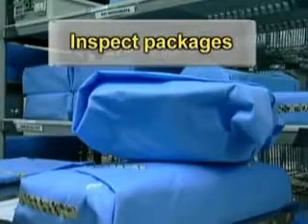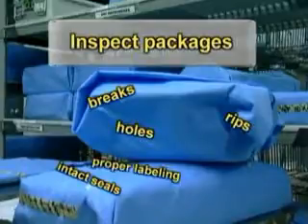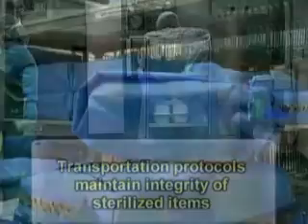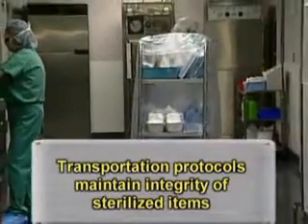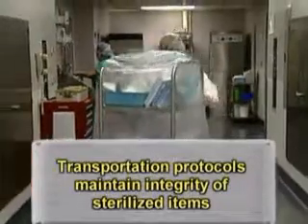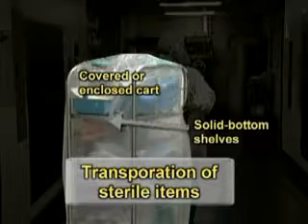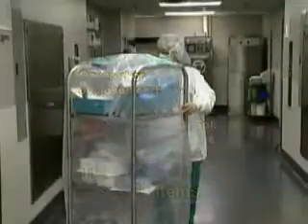Sterilized packages should be inspected for breaks, rips, holes, and for intact seals and proper labeling. Transportation procedures for sterile items can help prevent damages and preserve the quality and integrity until the time of use. Sterile items should be transported in covered or enclosed carts with solid bottom shelves.